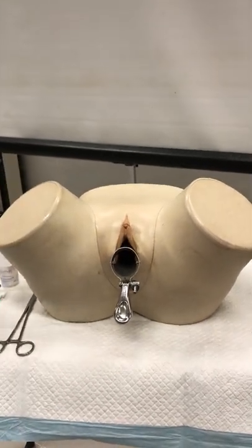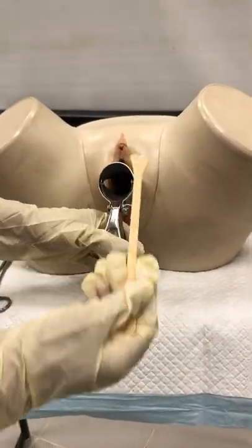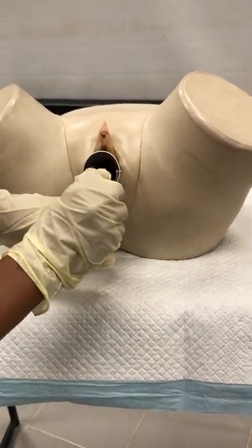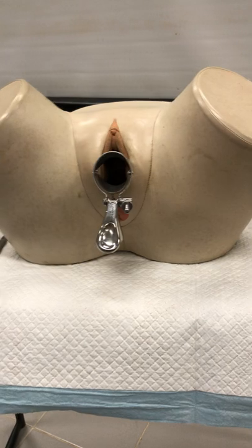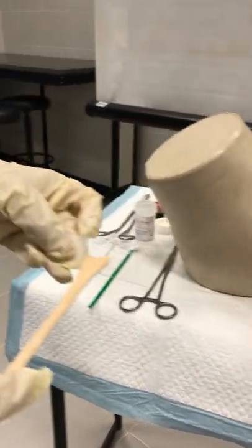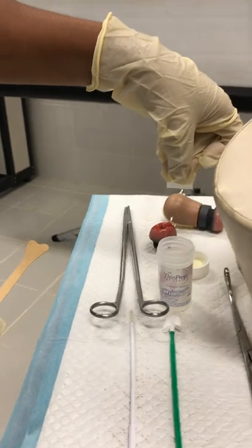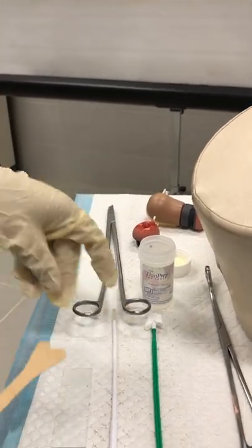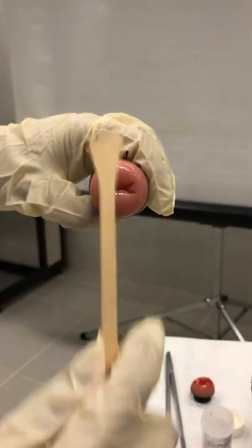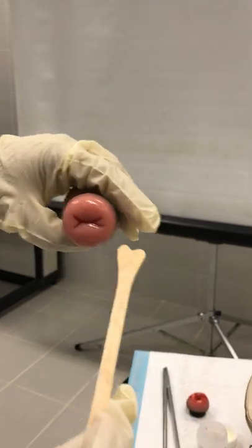For the conventional technique using the spatula: the Ayre's spatula tip has to touch the cervix at the os. The moment you touch it, you turn 360 degrees and collect the smear on the spatula. Then you smear it onto the glass slide — only one time. After that, you place the slide into an alcohol-based medium container and send it for histopathological examination at the lab.